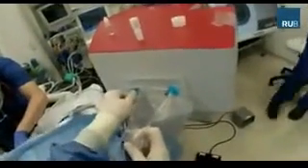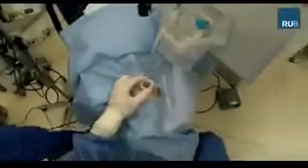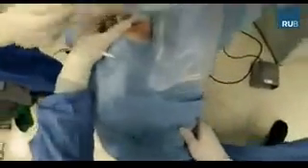After sterile draping of the eye, the suction ring of the liquid optics interface is docked to the sclera and filled with BSS. The patient on the bed is swiveled to the right under the laser and the suction ring is locked to the laser optic. Surplus BSS flows out through open channels and does not come into contact with the eye. The intraocular pressure increase is about 10 millimeters of mercury.